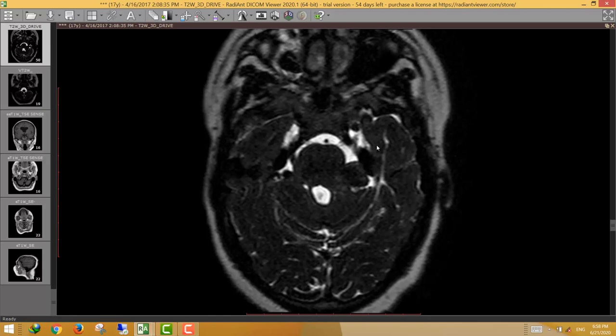These are the usual sites for cranial nerve schwannomas. If you do not keep these sites in mind, you can easily miss small lesions like the small Meckel's cave lesion seen here.